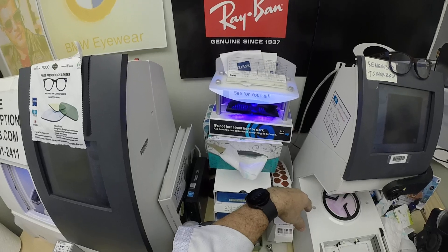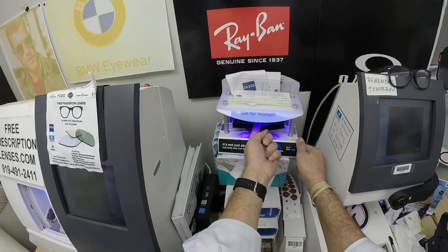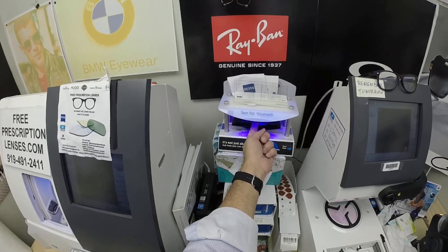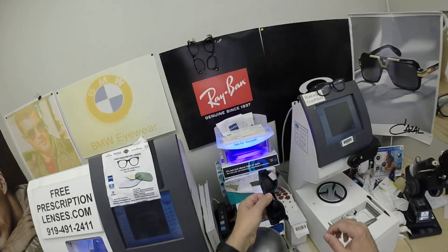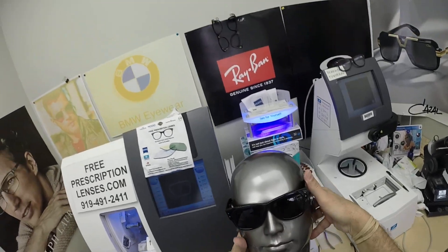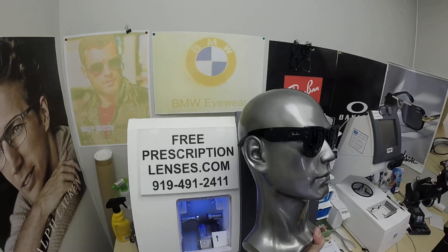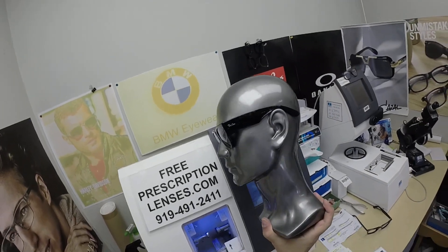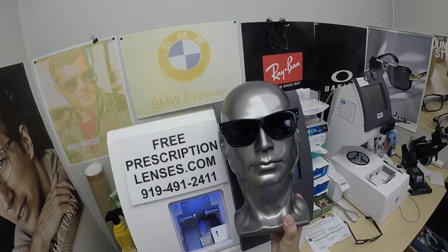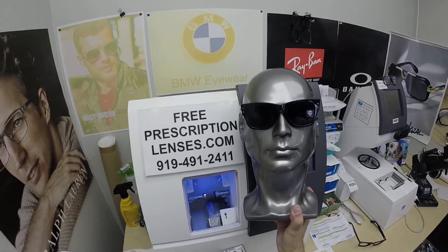All photochromic lenses get dark on day one and continue to darken every day for the first couple of weeks when exposed to the sun. After that they will work for years at maximum performance. The only time they won't work perfectly is if you're behind the windshield of a car — your windshield absorbs the sun's harmful ultraviolet rays, that's why they don't turn dark in a car. They're also temperature sensitive, meaning they will get darker when it's 85 degrees and below than when it's 95 and above. When it's 100 degrees outside, nobody or nothing works perfectly.